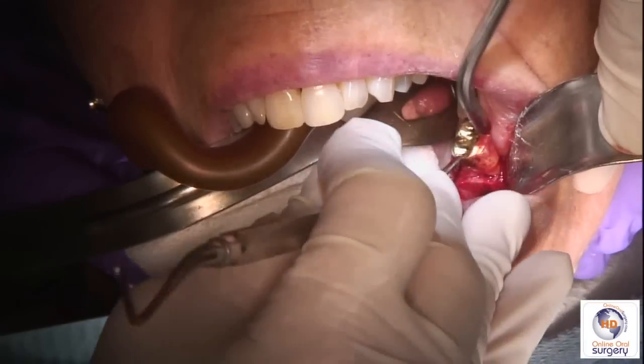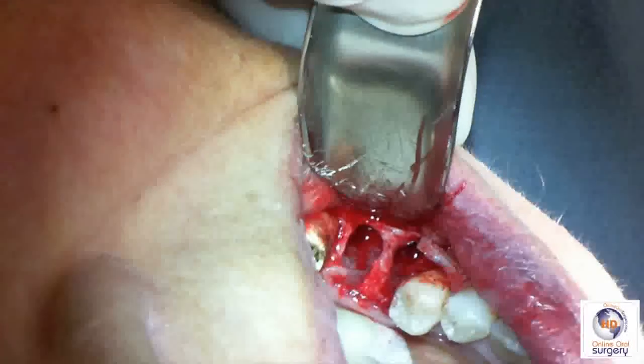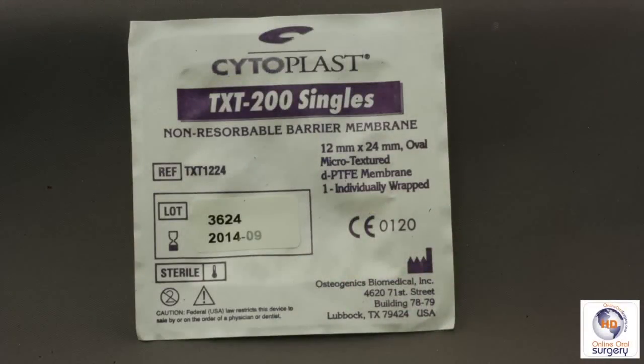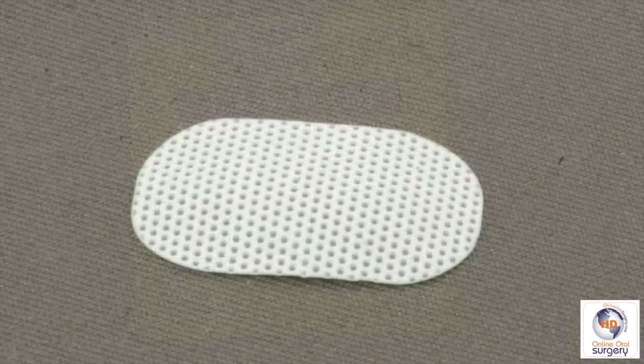It's not uncommon for the debridement process to actually take longer than the extraction. You'll notice what I'm doing is taking my curved curette and developing a pocket on the lingual — that's going to help secure our membrane. We're going to use Cytoplast in this case. This is a porous polytetrafluoroethylene, or PTFE, membrane — essentially like Gore-Tex but a little bit more porous. Unlike Gore-Tex, which had to be removed if exposed to the oral cavity, the Cytoplast membrane can be left in situ even if there's dehiscence of the mucosa over it.